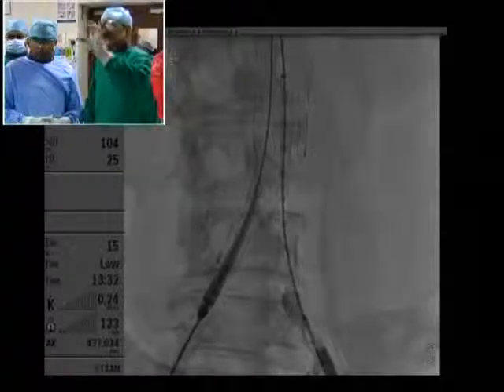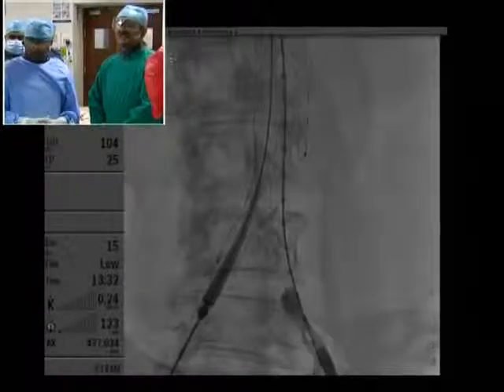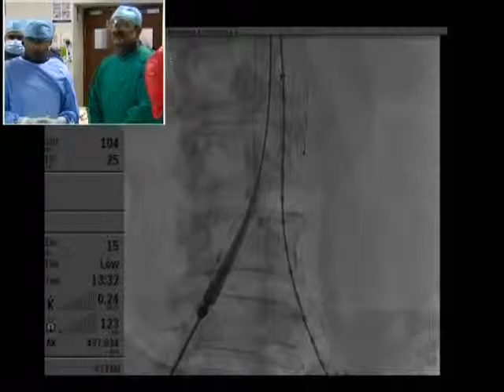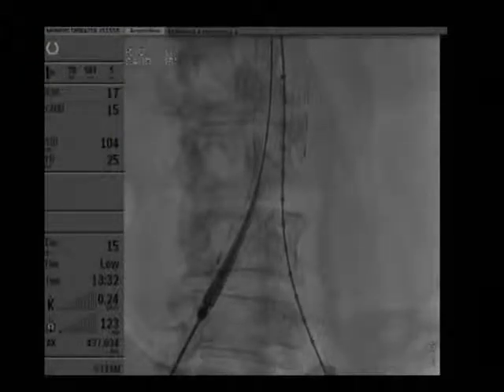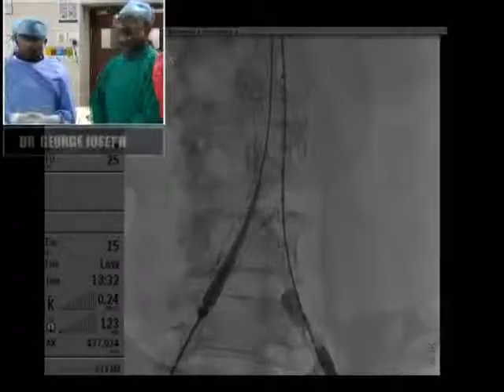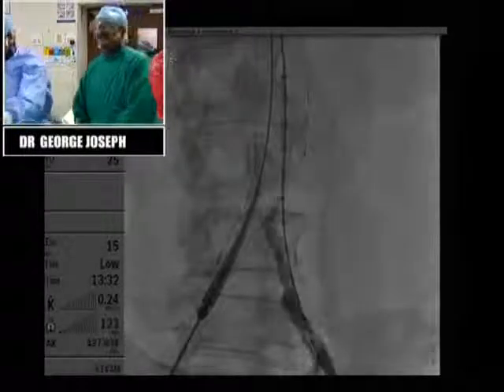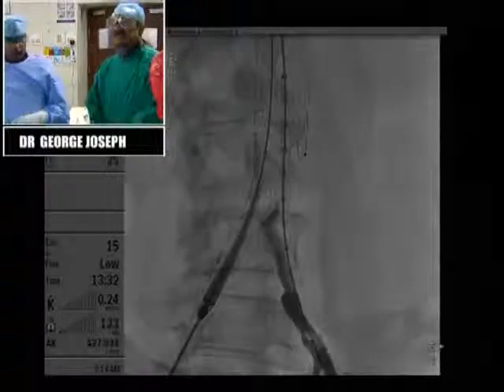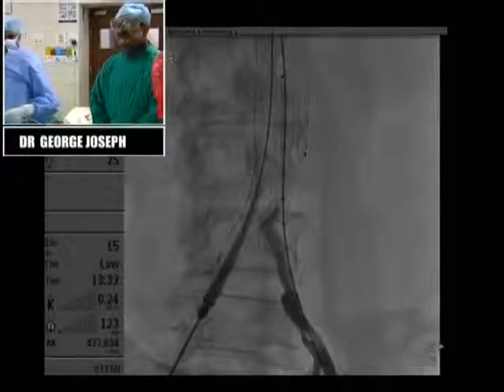What is that small bulge-like thing a little above? I think it's the straightening of the vessel. It's just an accordion effect above the internal iliac, from the wire. That's just the accordion effect. Okay, I'll take your opinion on that. So we'll take the 90 then. I think 90 should be okay. We'll take the 90 and hope that that's just a straightening of a bend in the artery or something like that. Once you release the stiff wire, you have more length there.